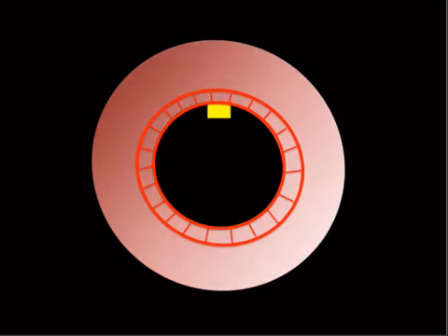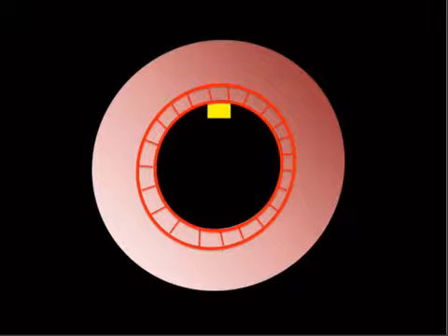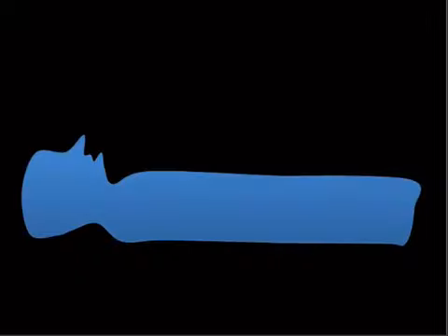So we have that going on. As the scanner turns, shoot and turn it again. Of course, that's happening super fast with lots of different things. That's the general idea. So I'm going to start introducing topics that are more high yield.